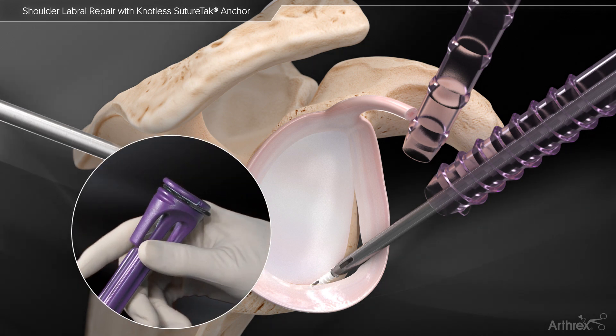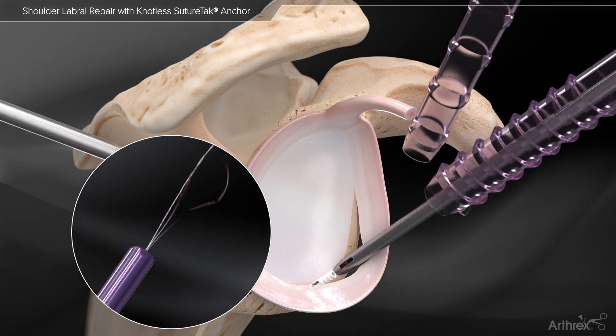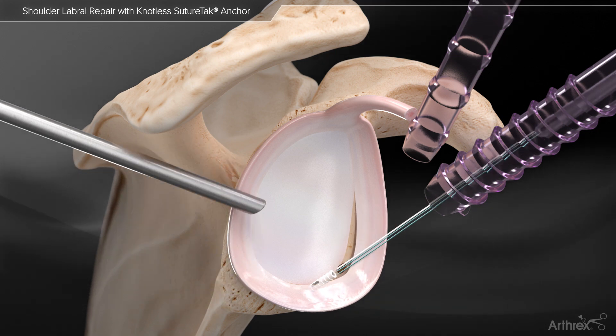The suture release tab is removed from the inserter handle. Then the inserter and guide are removed, leaving two strands of the 2.0 Fiberlink shuttling suture and FiberWire repair suture.